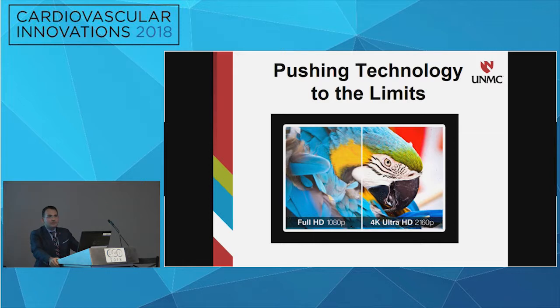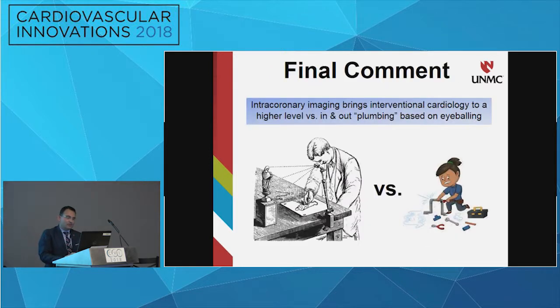And where do we move forward, what's next? So already in the technology, we have the 4K ultra high definition, which makes the full high definition look outdated. What's next in the IVUS? For now, let us enjoy the high definition. The high definition IVUS is here. It's the state of the art at this point in the technology of this modality, and along with OCT is the state of the art in intracoronary imaging.